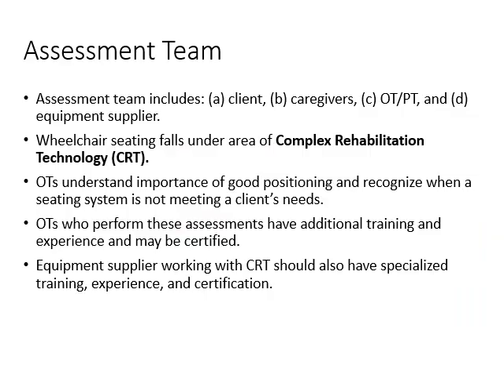I mentioned that the wheelchair and seating assessment includes a team of specialists, and this assessment team includes first and foremost the client, the caregivers as well, the occupational and physical therapists who deal with functional mobility, and the equipment suppliers. Those are very important team members. Wheelchair seating falls under an area of complex rehabilitation technology, CRT. This means that this is technology that has to be personalized to the person. It's not an off-the-shelf product.